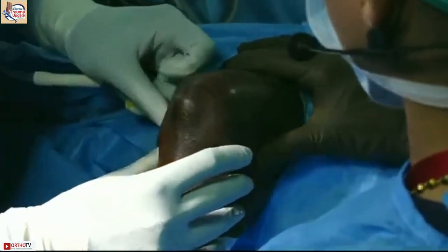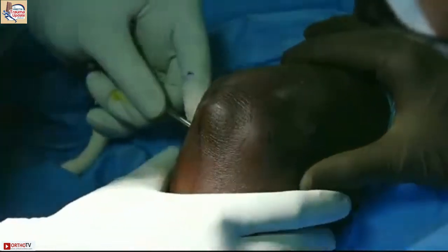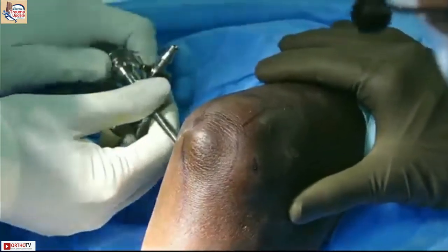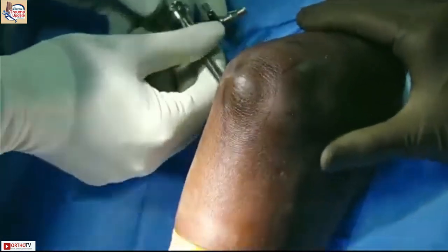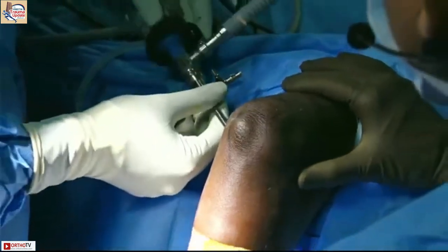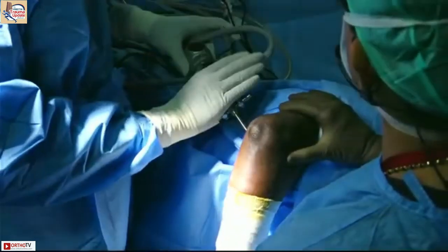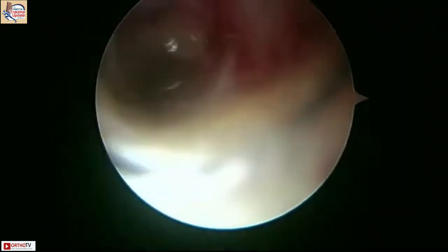What are the indications where you have to explore the ulnar nerve first before we go for this portal? So normally the ulnar nerve is never explored. It is marked. For every arthroscopy, things are just marked so that you know where they are. And then obviously there is an element of a learning curve for this. But you can start off by holding the ulnar nerve with your finger and then doing it. Once you do a few, you will know that it really doesn't need to be done because you are ventral to the ulnar nerve rather than dorsal.